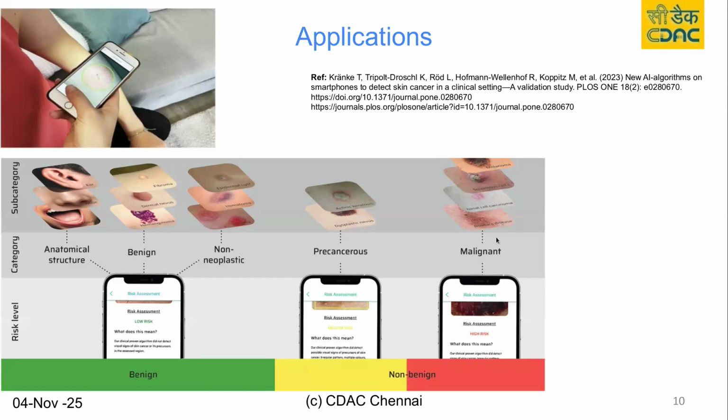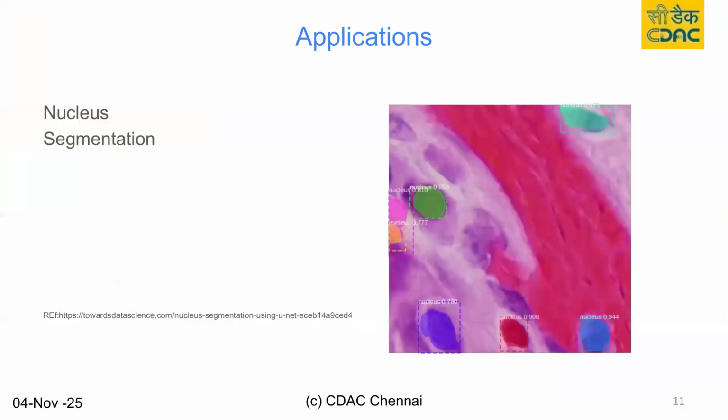The AI model in this Apple mobile app is trained to detect these conditions from the input image given. It will tell whether it is low risk, medium risk, or high risk, whether you have to contact the doctor. Is it a cancerous thing or not?